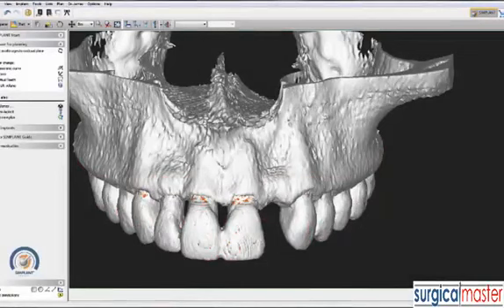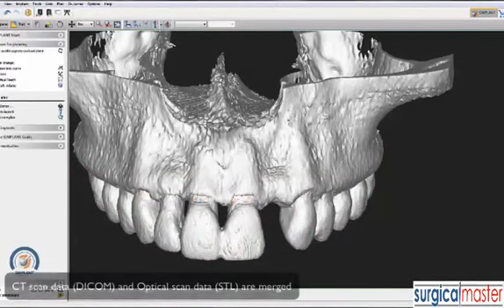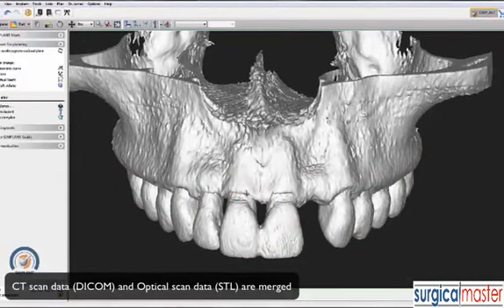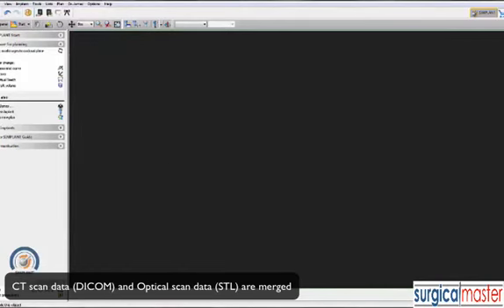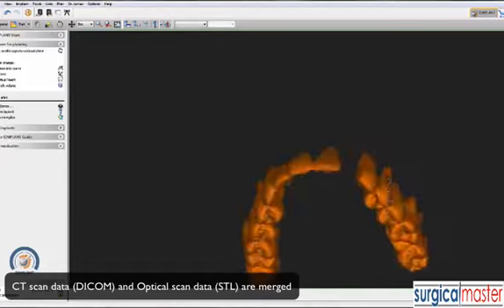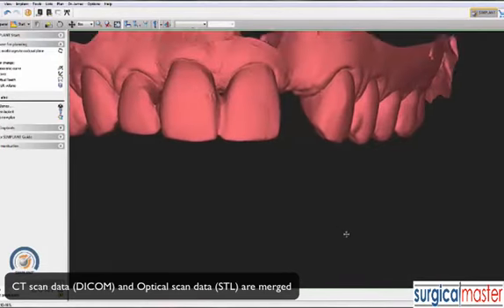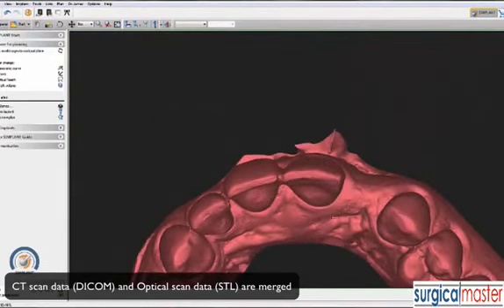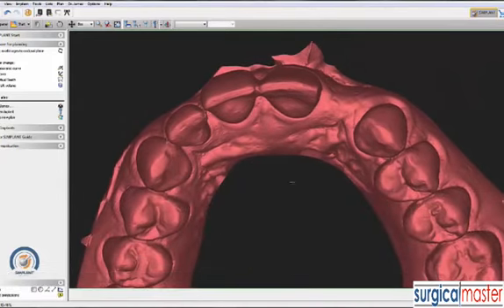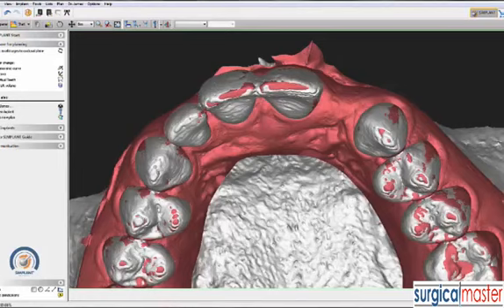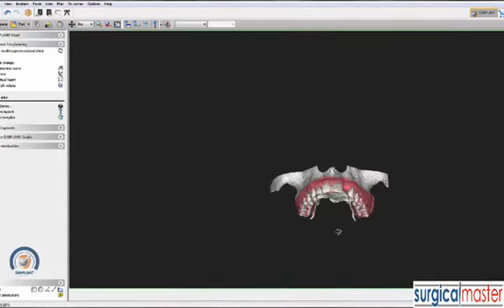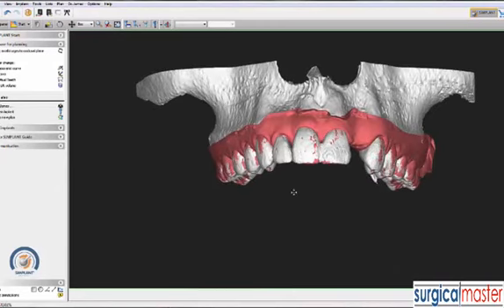We have two sets of data. One is the CT scan, the DICOM from Halpert — here's the 3D rendering, along with the rendering of the individual teeth. Number two, we have the model of the edentulous area obtained with the optical scanner, in this case the iTero machine. The two sets of data are merged, and now we have basically a virtual model that we can plan our implant on.